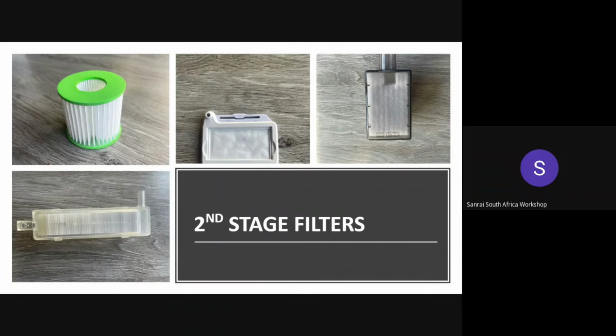They cannot be cleaned and they cannot be reused. It is recommended to replace the HEPA filter every 6 months and the paper filter every 5,000 hours of use. The long-term use of these oxygen concentrators in dusty environments requires the filters to be replaced more frequently.